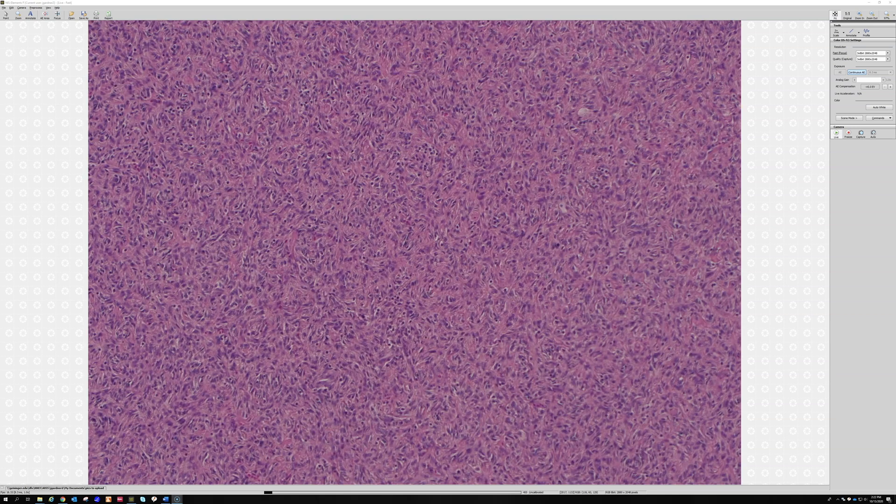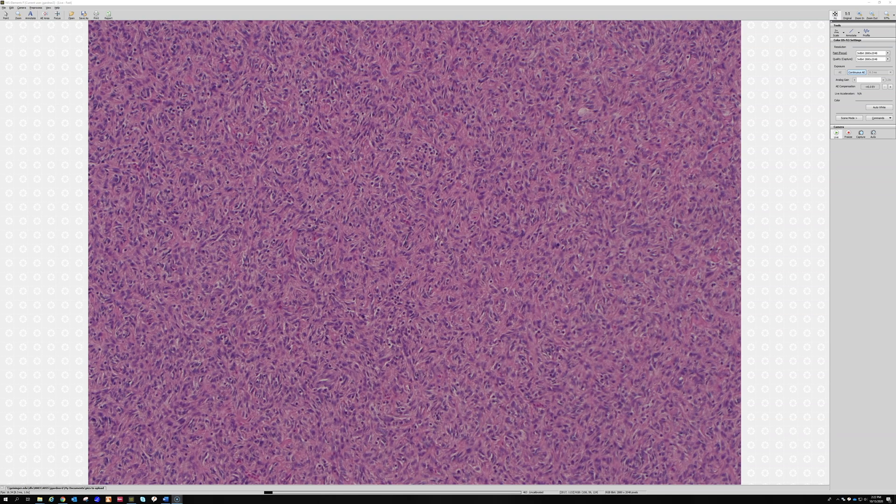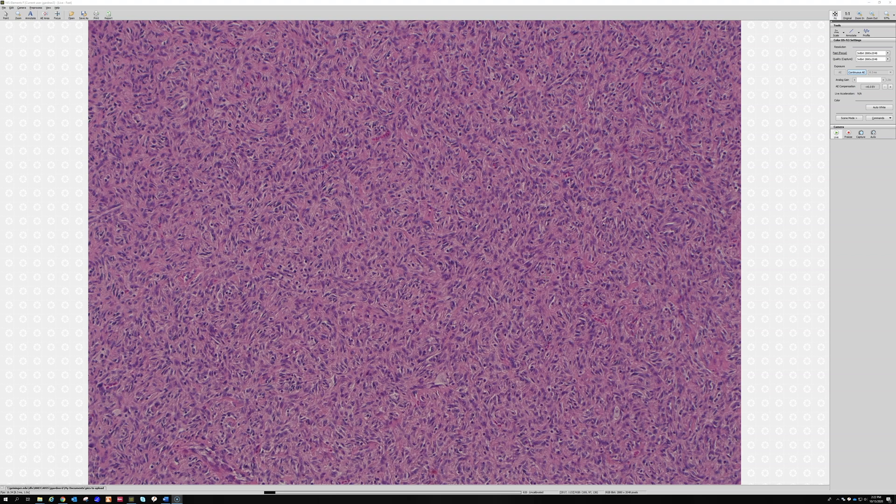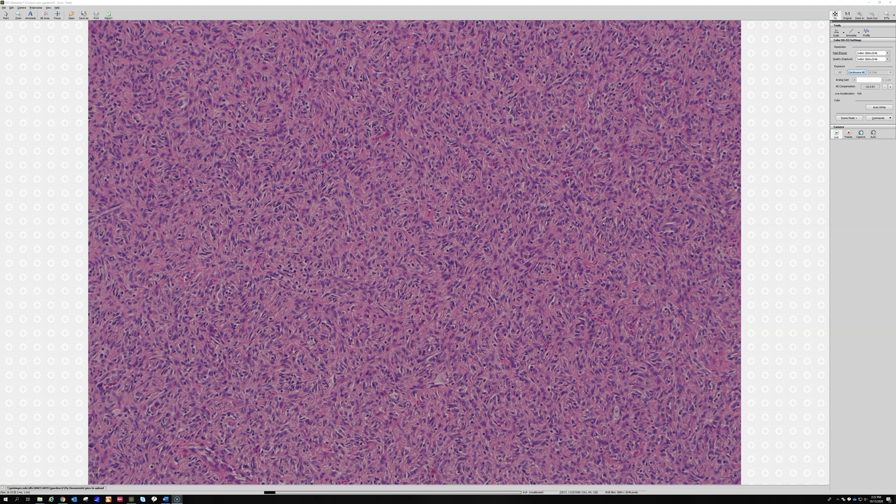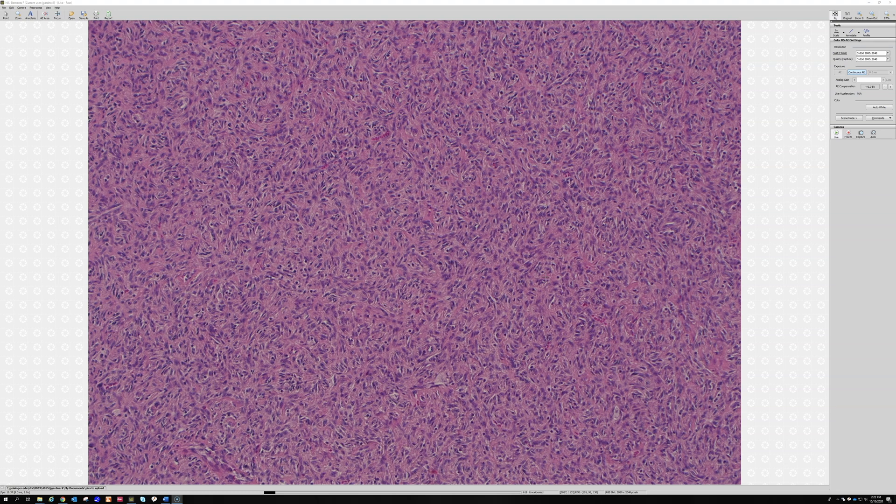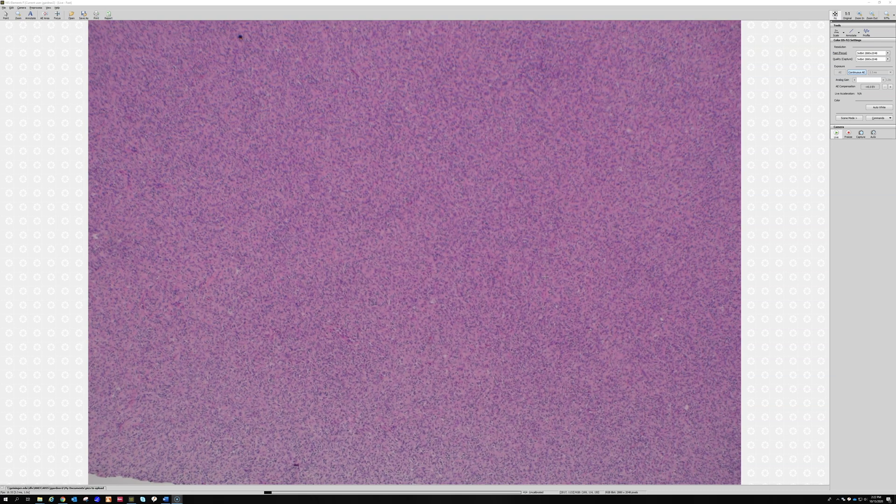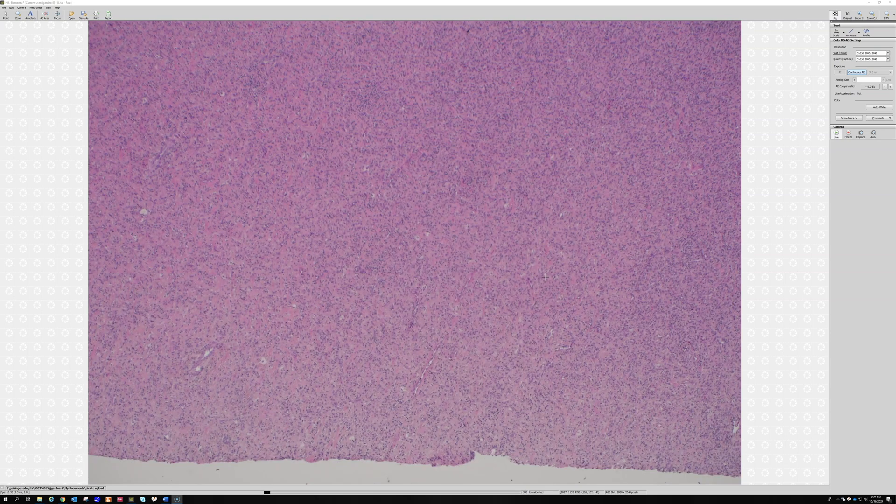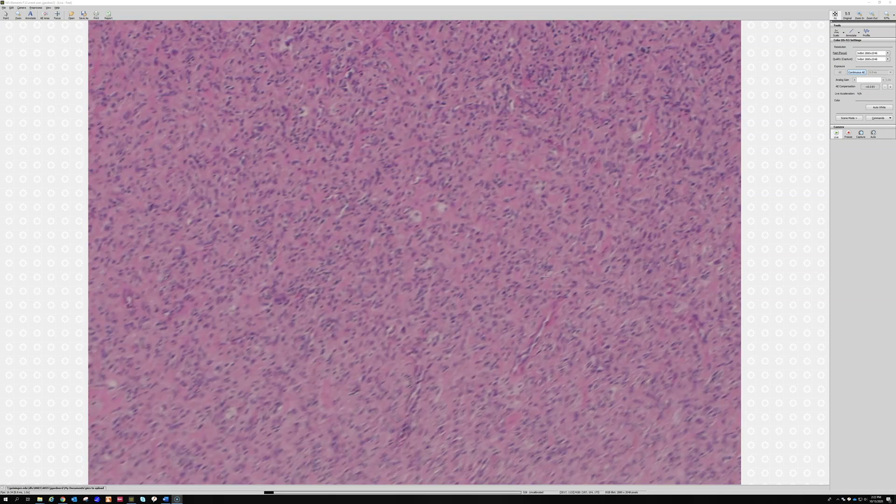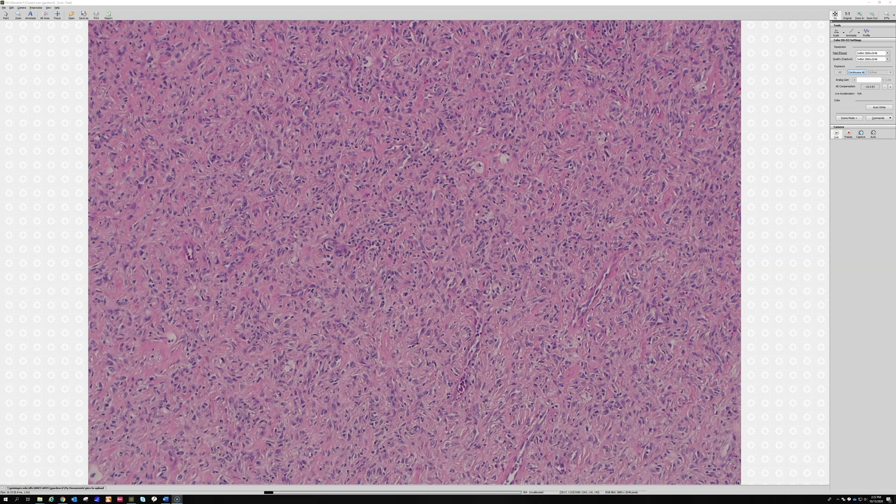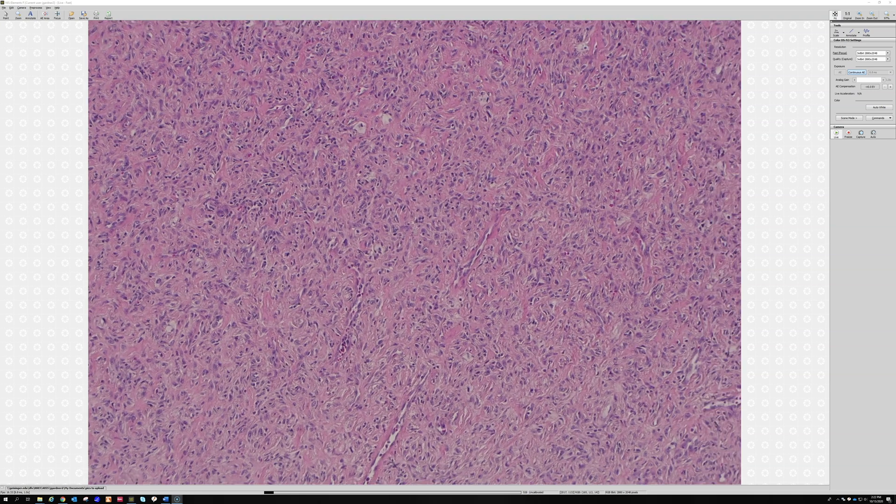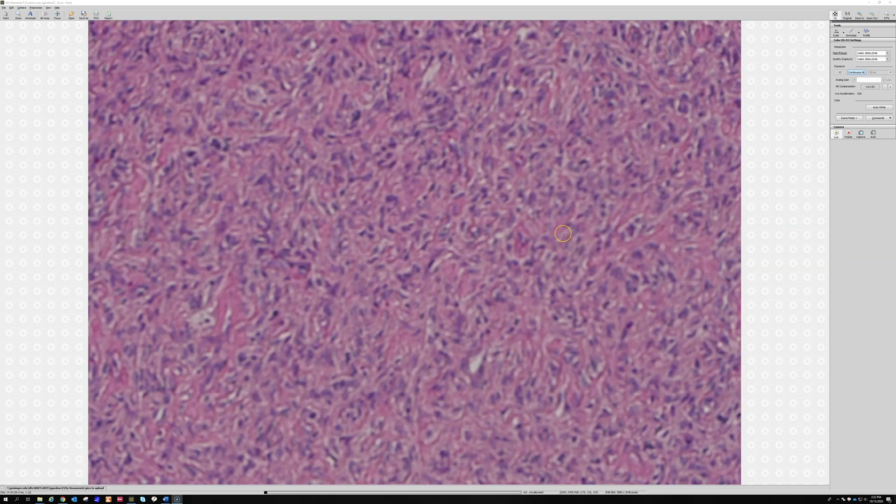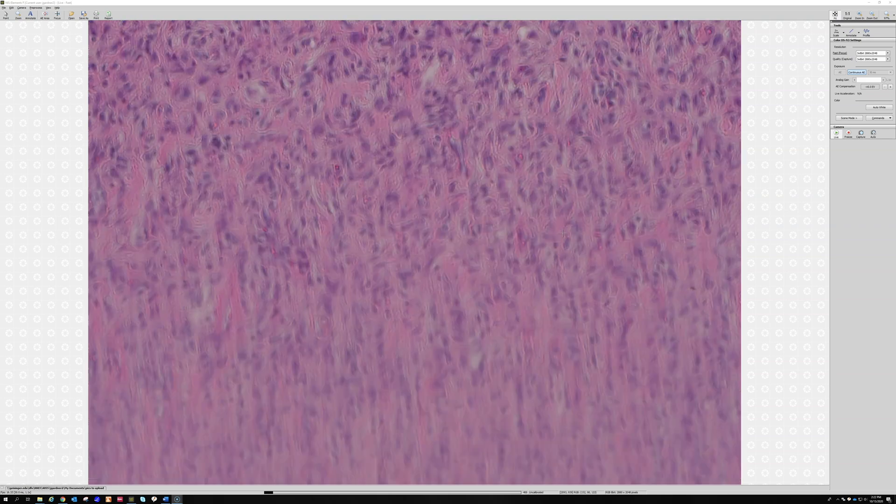The reason that I like this one is because most people never encounter a DF this big, and it's just not on your radar after you've seen some during a dermpath rotation or in a book. It's not on people's radar to imagine that a DF could be this big. I remember even the surgeons who were pretty experienced soft tissue surgeons who saw this, they were shocked. DFs can occasionally be quite large and the big ones tend to get people really worried. In these ankle type lipidized DFs, they often get these really dense homogenized pink collagen. This one doesn't have it nearly as much as some of them do, but the collagen they kind of make their own sclerotic collagen and sometimes it runs through the tumor and wraps around the cells.